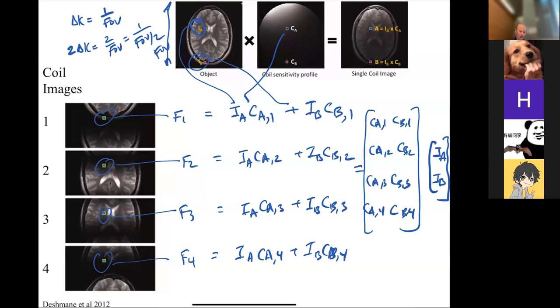The reason why it's getting darker is, let's say in this case, the coil sensitivity is lower here, right? Than that alias part. The part that gets plopped here, it gets plopped there, but the sensitivity is so low there, its value gets downweighted. So the darkness you're seeing is basically this coil sensitivity here, right? It's very bright up here and it's much darker down here. So that's for one coil, and every coil is going to have areas that it's sensitive to. Okay.